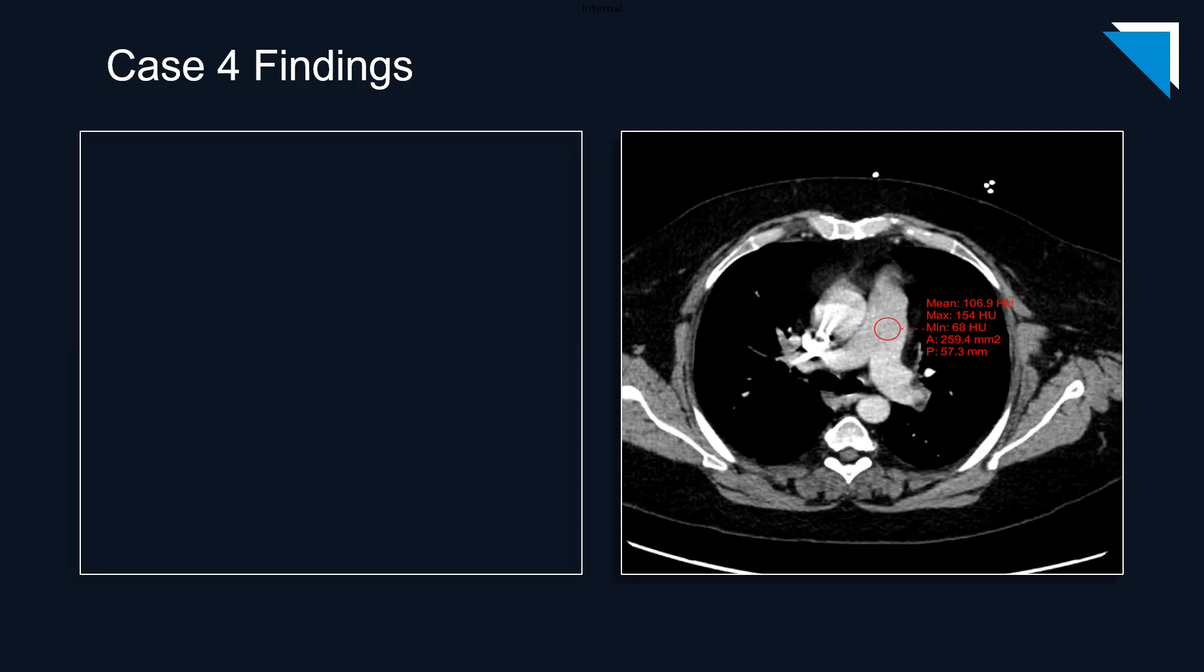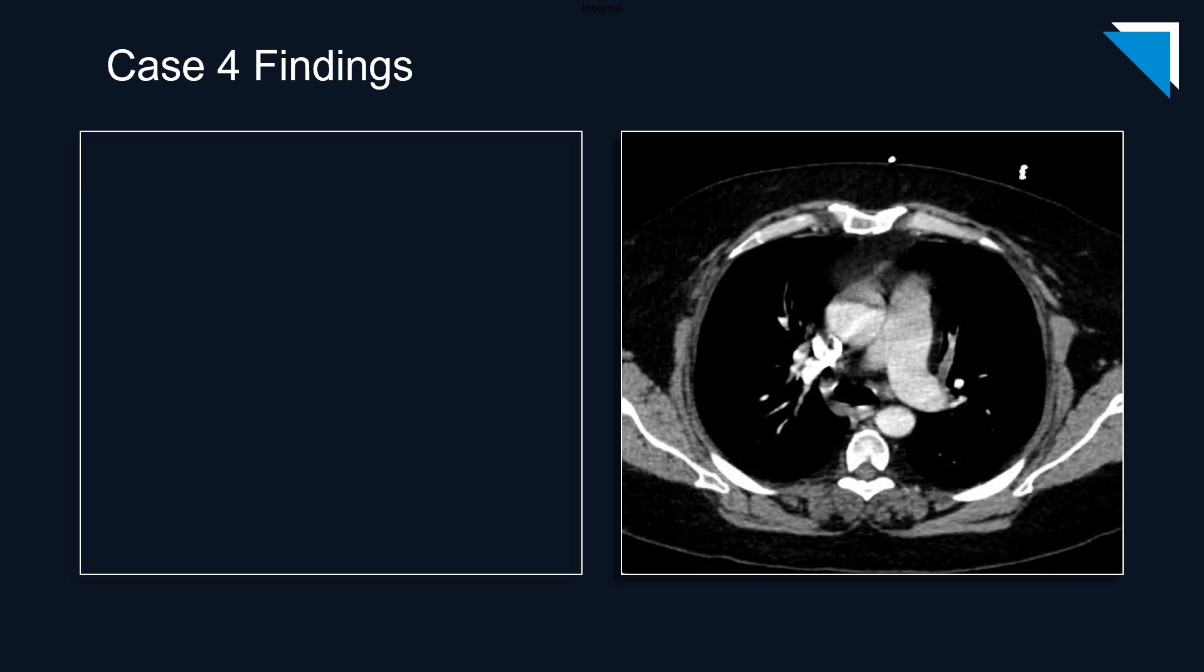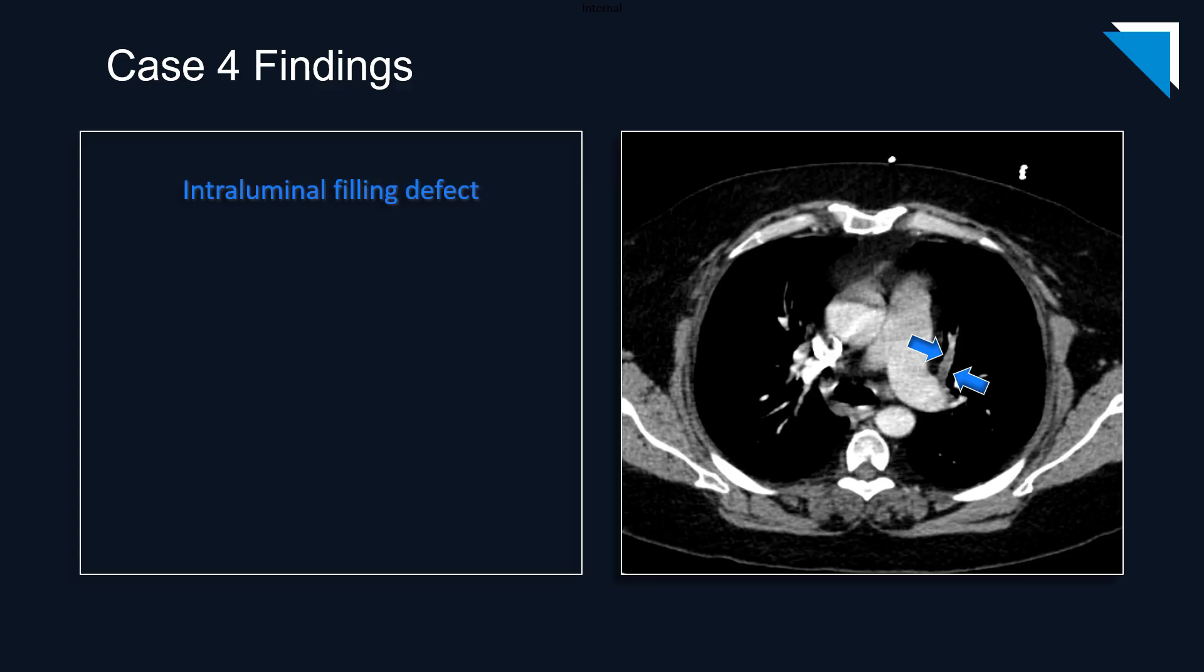The first thing I'd like to point out is that there is suboptimal enhancement of the pulmonary arteries. Here you can see the mean Hounsfield units of 107. We should be at 200 or above for an optimal study. But in spite of the study limitations, we can still identify intraluminal hypoattenuation in a branch of the left upper lobe pulmonary artery, which is, of course, consistent with a pulmonary embolism.